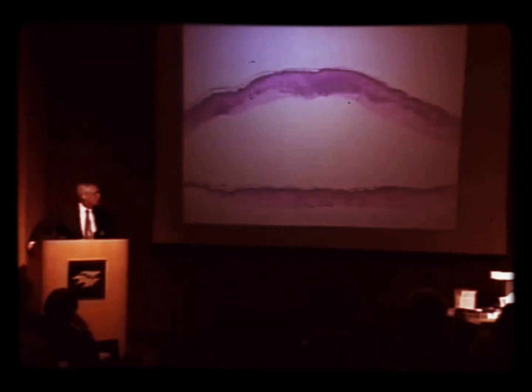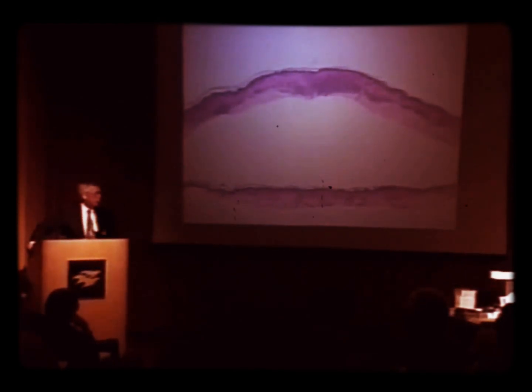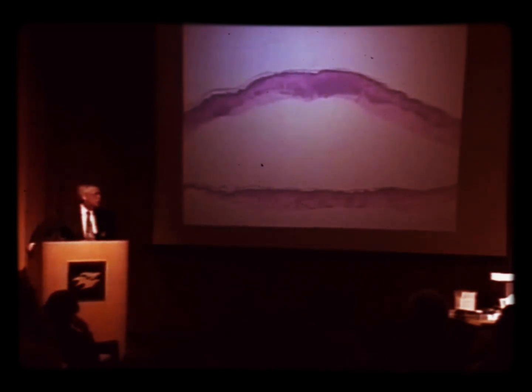In defense of the clinician, the entire lesion is here, which should not handicap us as dermatopathologists. No, and the specimen is not stretched, it's well preserved. This is not an attack on the clinician. The clinician doubtlessly is a very fine person, treats his wife beautifully.